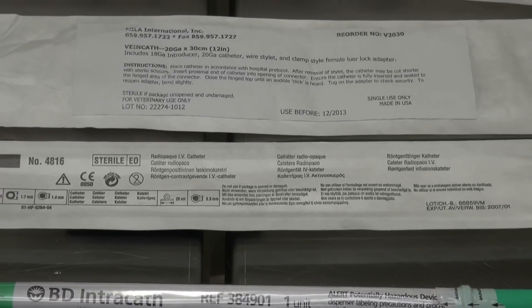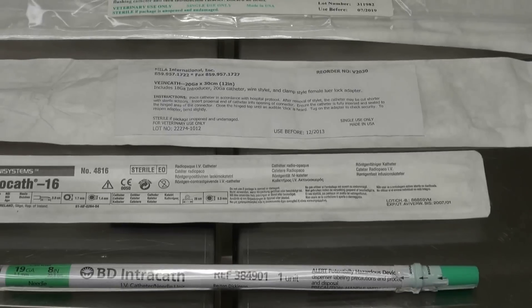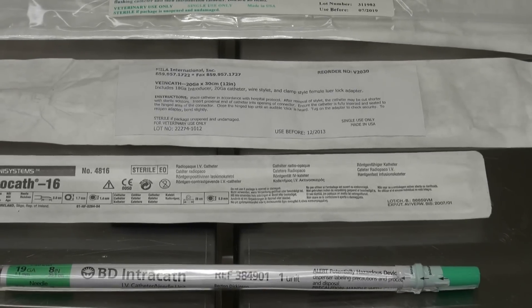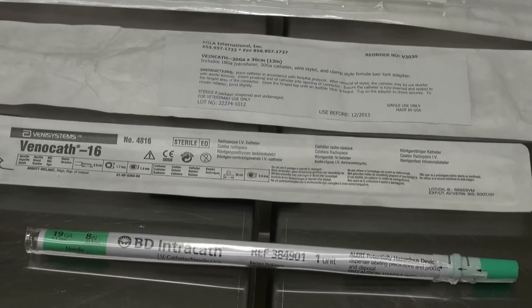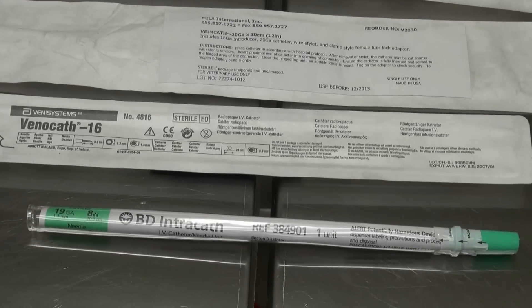For purposes of the laboratory we're going to use the Becton Dickinson Intracaths. They come in 8 and 12 inch lengths. 8 inches is rather short for a good-sized dog, but it's the one we're going to use in this demonstration.